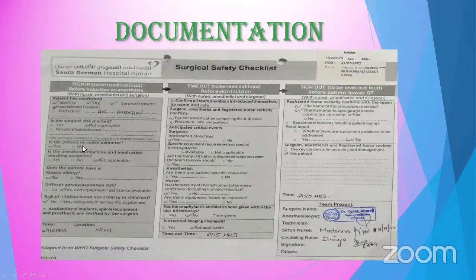Is the pulse oximeter attached? Yes, attached. Not applicable for the anesthesia machine. No allergy. Difficult airway? The baby is on CPAP. Risk of more than 500 ml of blood loss? No. And then the time, date, and location. The date should also be written.